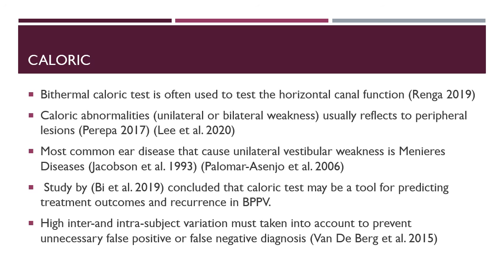But studies also show that we must take into account the high inter and intra subject variation in caloric testing to prevent unnecessary false positive or false negative diagnosis.